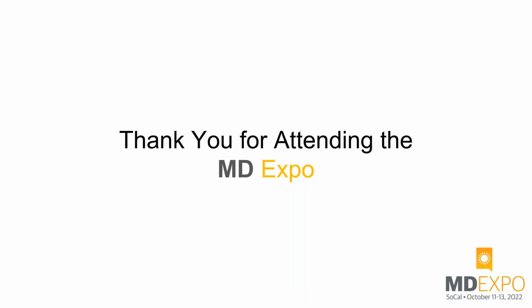So the vitals wouldn't be incorporated with the app. The vitals you get from the physiological monitor on the wall. It only would just be alarms. Yes, so the Gieras app that I talked about would be just the specific alarms, the red, yellow, and blue that we have selected to go directly through the Gieras app to the end user communication device, which is the iPhone. Okay, perfect. Thank you. Apologize, everybody. Good question.